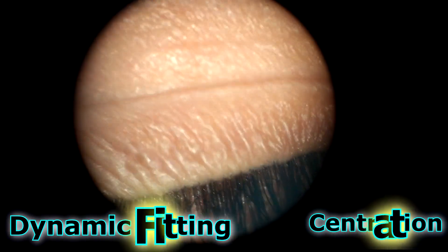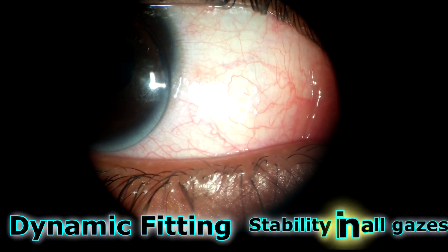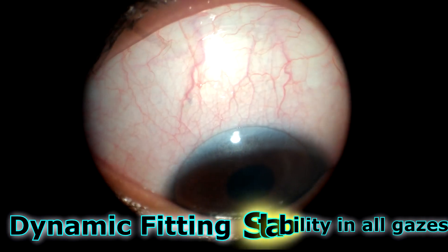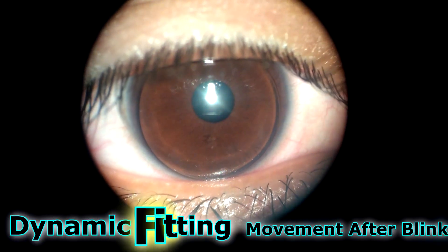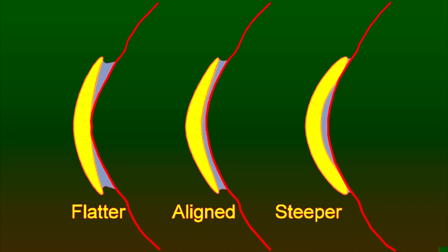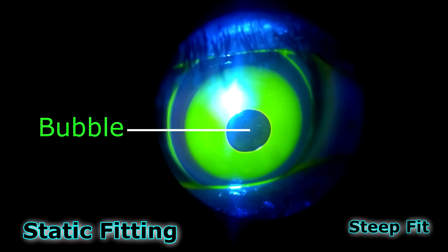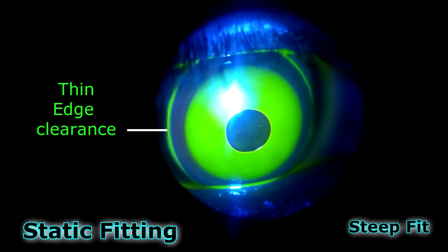There are two types of fitting assessment: dynamic fitting assessment and static fitting assessment. In dynamic fitting assessment, we have to check the lens position and ask the patient to look up, down, right, and left, and observe the lens. In this case we can see the lens is riding high and is unstable, not centered well. In static fitting, we use fluorescent dye and look at the central, mid-peripheral, and peripheral zones. Steep fitting is characterized by excessive central clearance, heavy mid-peripheral contact zone, narrow edge width, and reduced edge clearance.